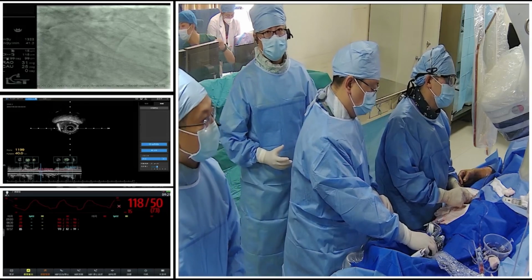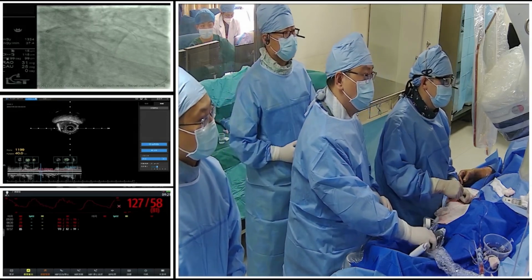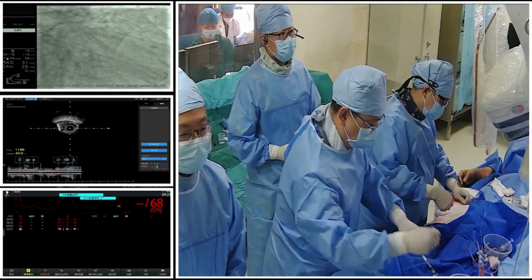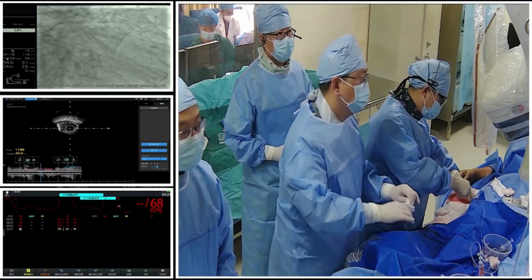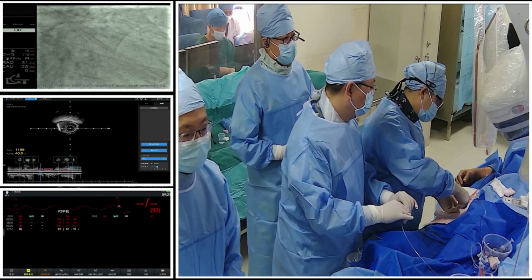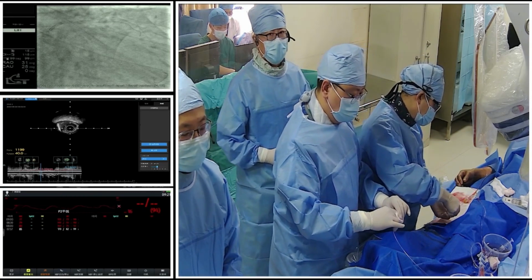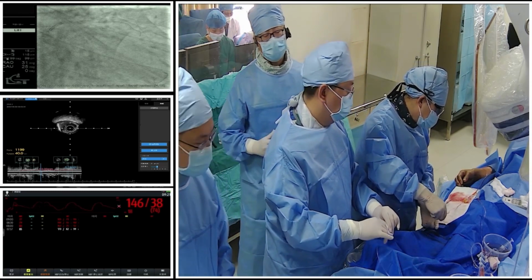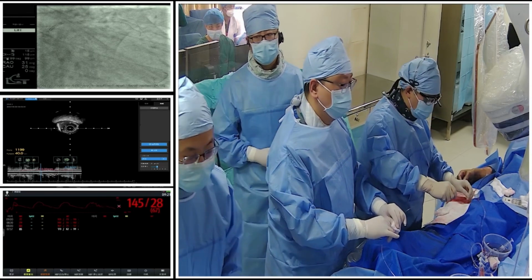My name is Lesion. I'm the moderator, and the first operator is Dr. Gong Yongcai, and the rest of the operators are Dr. Zhao Jiyi, Dr. Sun Danghui, Dr. Li Tiankai, and Dr. Wang Dingyu. Today is the IVL day. I think our enemy is the calcification. So first, Dr. Zhao will introduce the case.